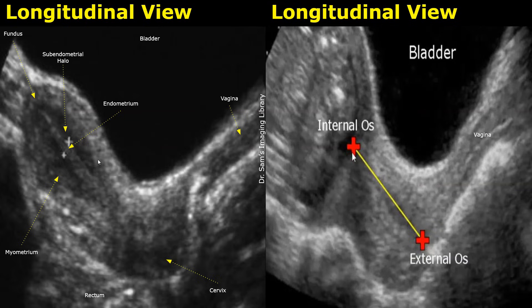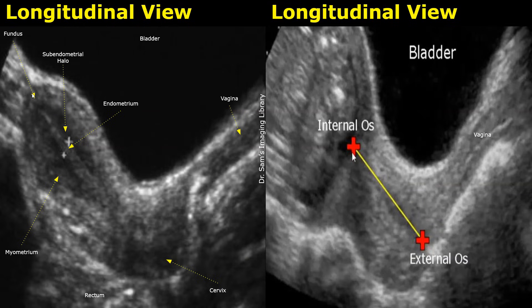First, we will look at transabdominal images of the uterus in the longitudinal plane. This is the uterus. The bladder is anterior to the uterus and appears anechoic when it is filled. Its uppermost part is the fundus. The middle portion is the body, and the lower part of the uterus is the cervix.